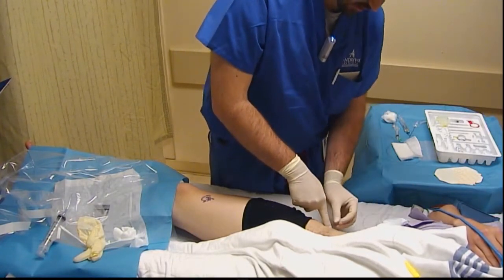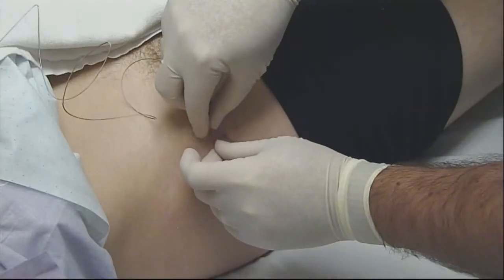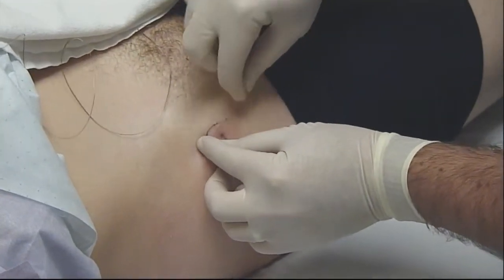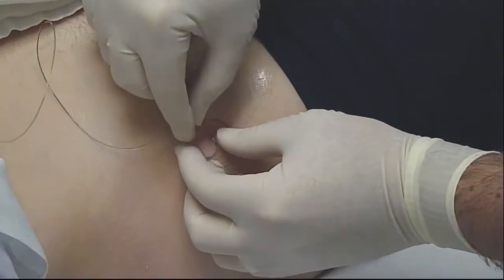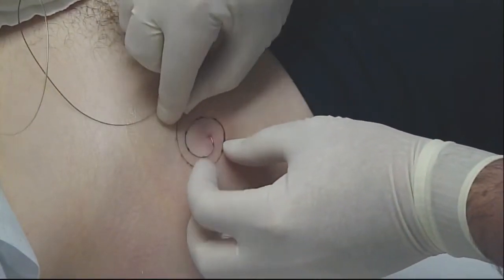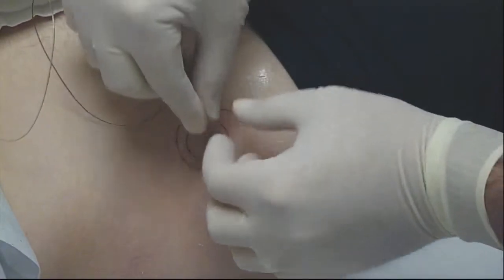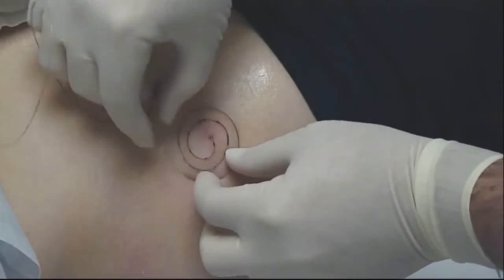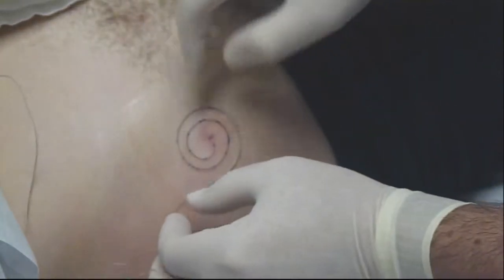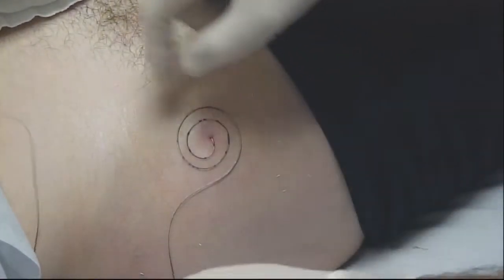Now that it's nice and sticky, I'm going to put a couple extra coils in here and we'll zoom in in just a second. I'm going to loop this catheter a little bit, making sure that tip doesn't come displaced at all. I'm going to wrap it around. This is yet another way we can help prevent it from dislodging — if it gets tugged on, hopefully it displaces these loops before it displaces the tip of the catheter.